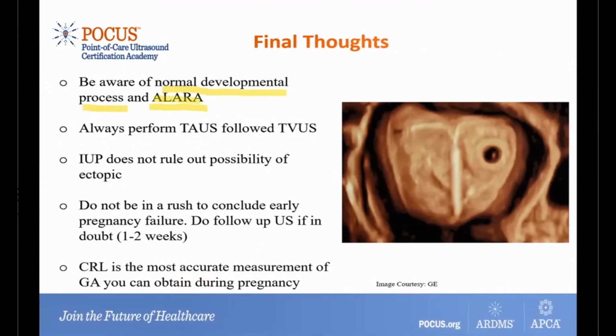So we do not want to use power Doppler or color Doppler during the first trimester, because first of all it is not providing us any additional information, and we do not want to insonate the developing embryo with high acoustic power, because that can potentially cause some injury, even though as of today, as I mentioned earlier, there is no documented evidence of that. But it is always a good idea to keep the environment safe for the developing embryo and the organogenesis that's occurring.